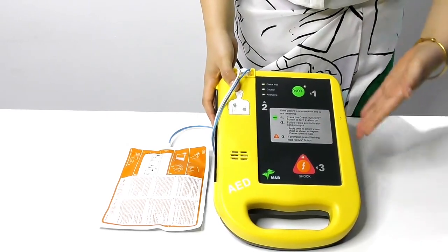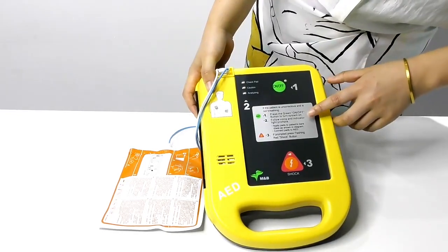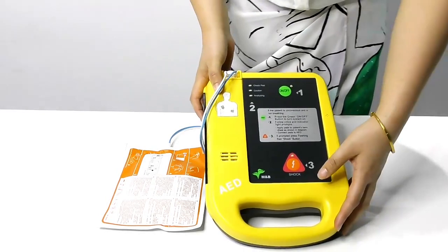The second step, it will analyze. We can follow the voice and indicator lights prompts. It's very easy to operate.